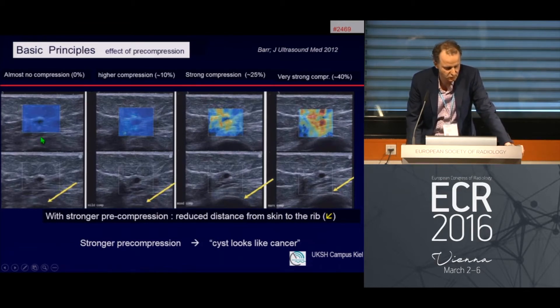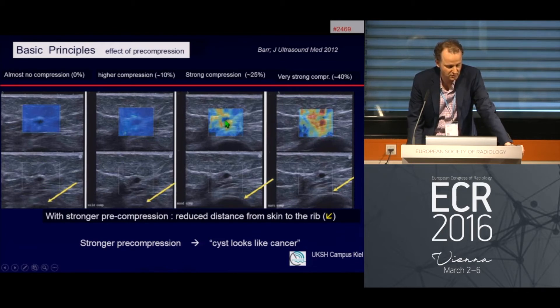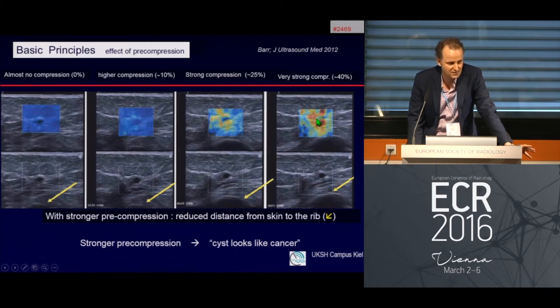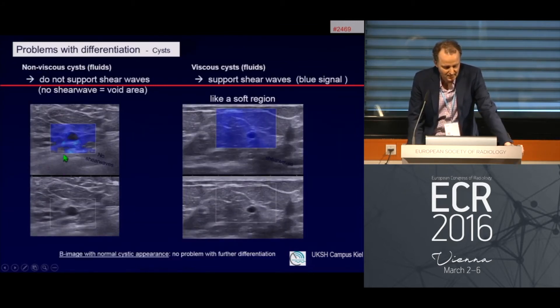Pre-compression is really important. With gentle compression, you see almost no compression and the rib is at a distance from the skin. With more compression, the rib comes up. With very strong compression, what was an overall benign blue cystic lesion starts showing more artifacts, then becomes orange-red, and with even more compression it looks like a cancer. This can lead to a false positive — a cyst appearing malignant — if you do not remember that gentle compression is essential.